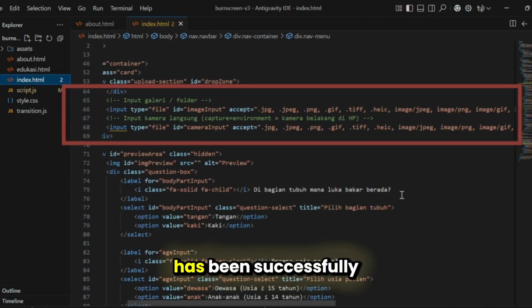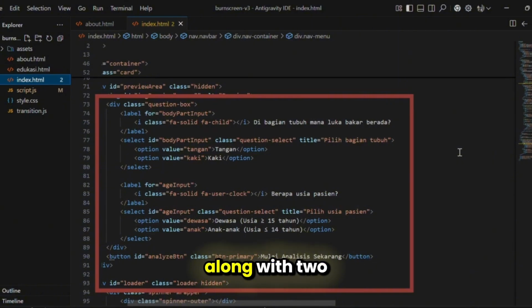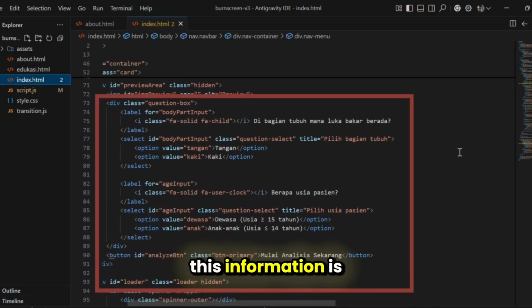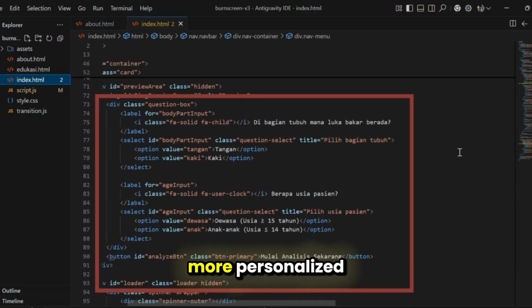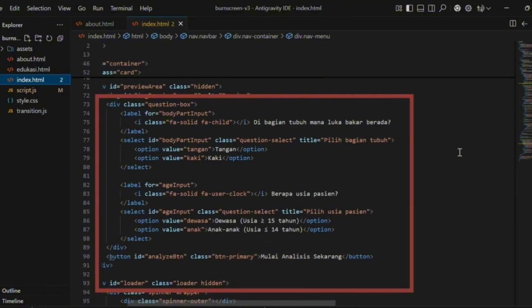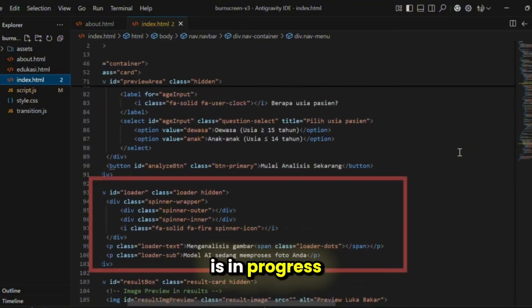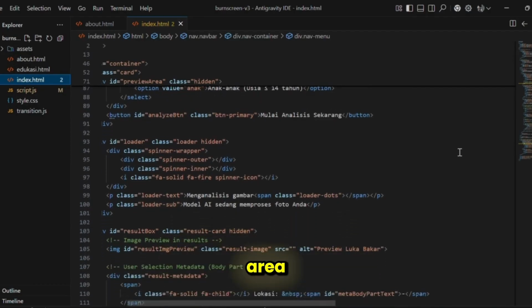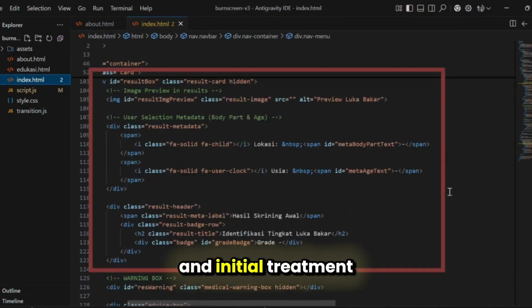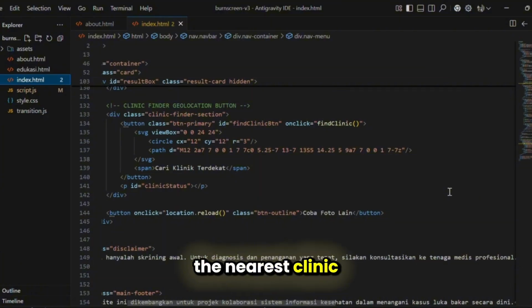Once an image has been successfully selected, the user will see a preview of the image along with two additional questions: the location of the burn and the patient's age category. This information is later used to generate more personalized medical recommendations provided by the system. Additionally, there is a loader component that appears while the analysis is in progress, a classification result area displaying the burn grade and initial treatment recommendations, and a button to search for the nearest clinic.